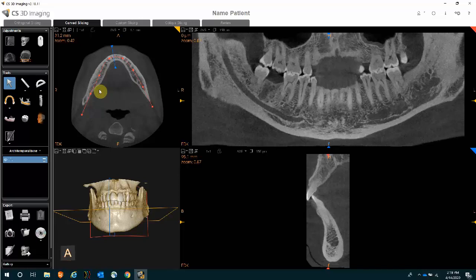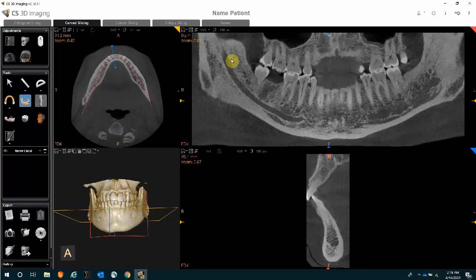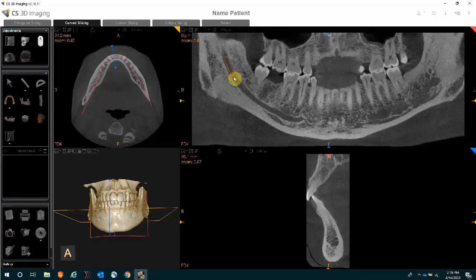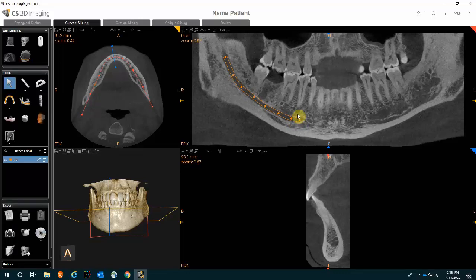It is helpful to then trace that nerve. Select the activate nerve canal tool — once it's blue, simply click right into the middle of the nerve and continue creating short clicks to follow the curvature of the nerve. When you get to the very end, double-click. You don't have to worry about accuracy here, because you can go back to any of the dots, click and hold, and readjust your tracing.